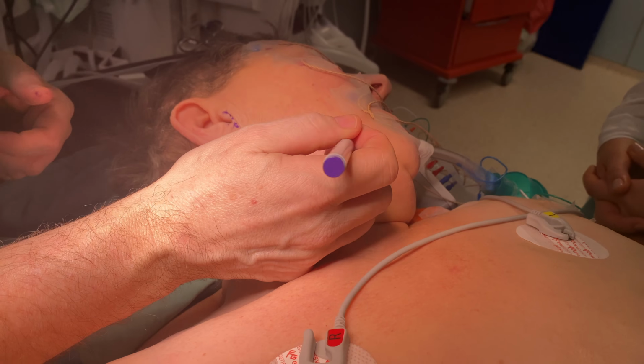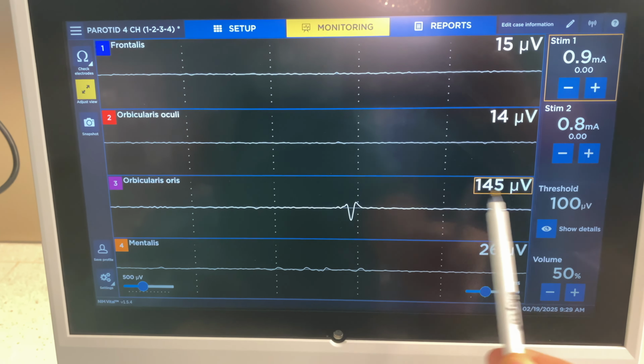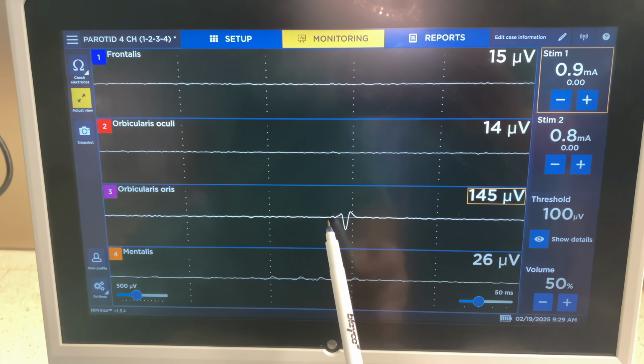We're going to find, so I'm going to make a mark. It tells me that that's where the marginal mandibular nerve is crossing the mandible. And it's a relatively low threshold, but there it is, and that's an action potential. Okay, so that's real. Now we see the tumor, the point where we're able to activate the marginal mandibular nerve, the natural crease, and now we're ready to begin.